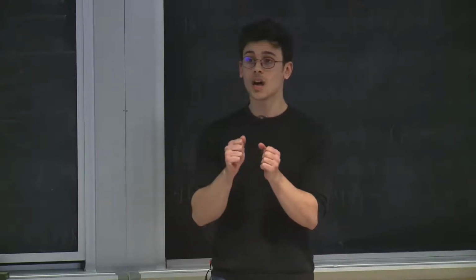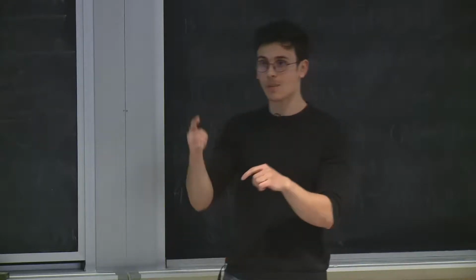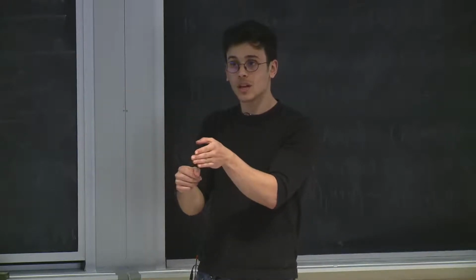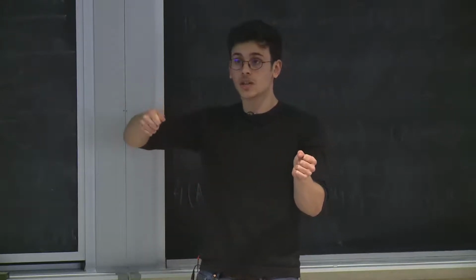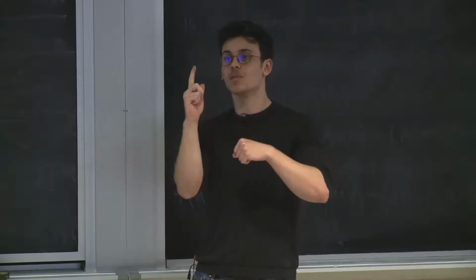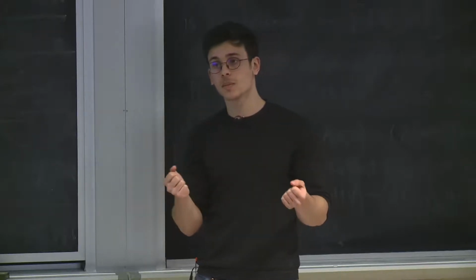Oh, so normally when you train the network, the most common approach is you do backprop and then step. If you just do backprop several times, you're accumulating the gradients, at least in PyTorch, and then you can do step afterwards. So instead of doing the whole batch at one time, you do it serially. There you're just trading time for space. The minimum, though, is you have to fit at least a single image per GPU. In our case, we can fit 3. But to make this actually scale, we use 4 GPUs at a time.